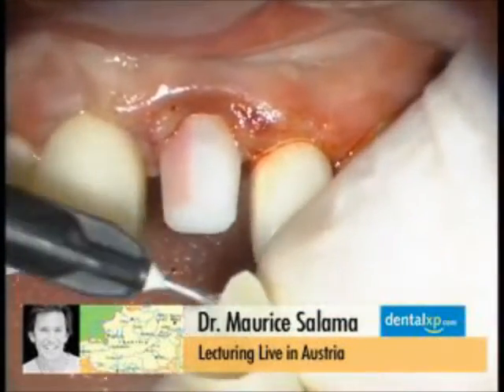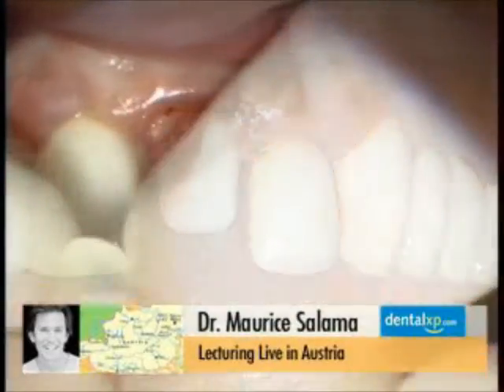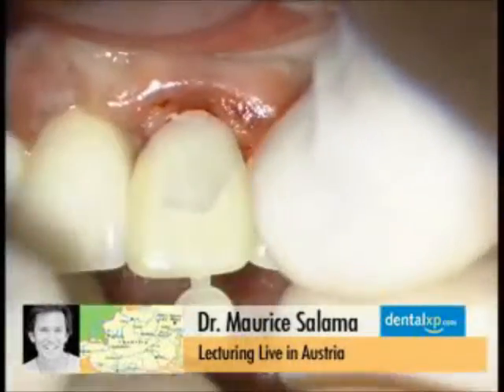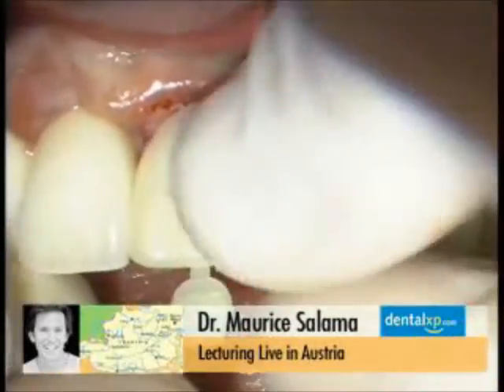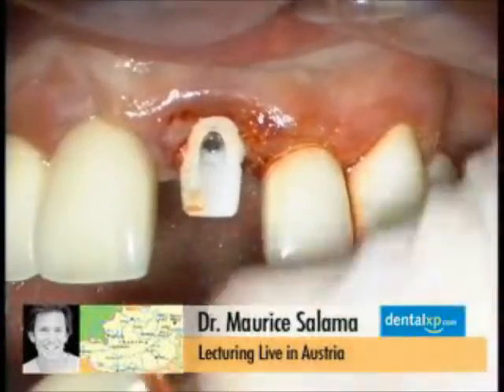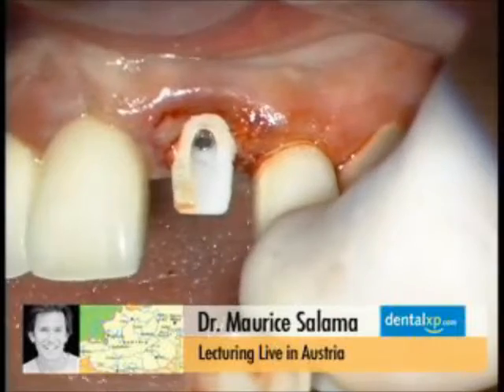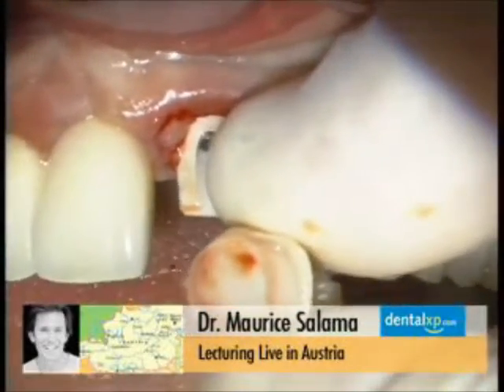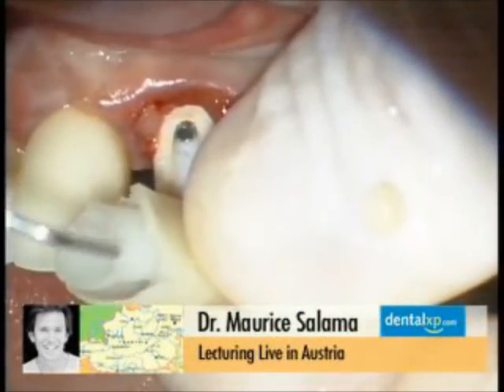This is something that we're going to hopefully be able to utilize today, utilizing Zyve to replace this tooth, utilizing the same concept, but this time placing the abutment at the time of surgery based on this kind of planning and guidance, securing it into place and utilizing a coping over the top. Transferring that to the laboratory and never having to take the abutment off of the implant from the day of surgery. And I know we heard yesterday how important that may be in terms of management of the microgap. Not having to put on and off the components doesn't allow for tearing of the junctional epithelium and maintains soft tissue height.